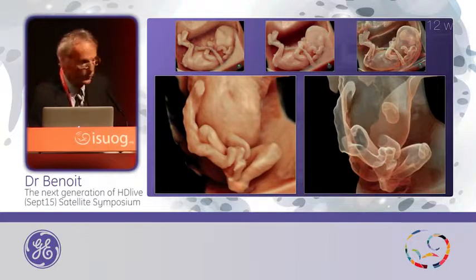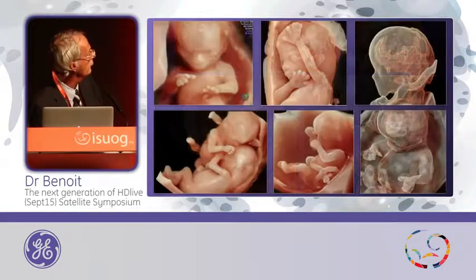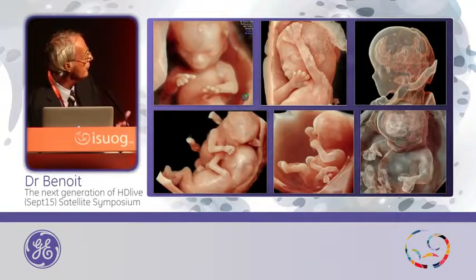And here, some examples of a normal fetus with different levels of silhouette.